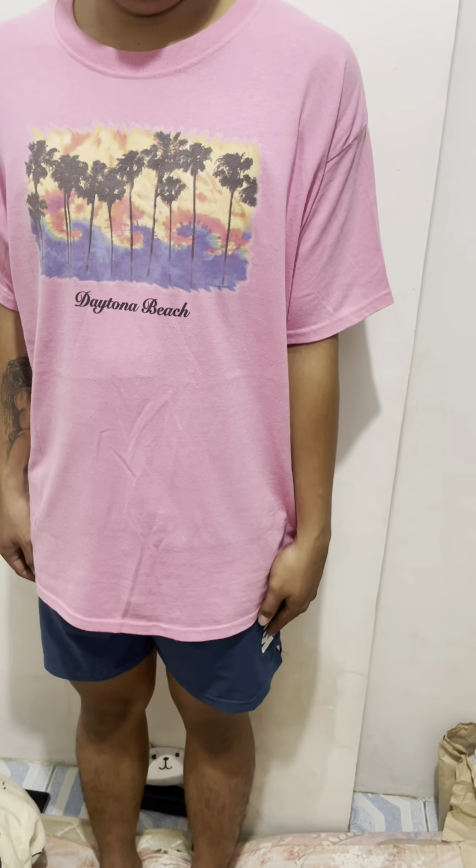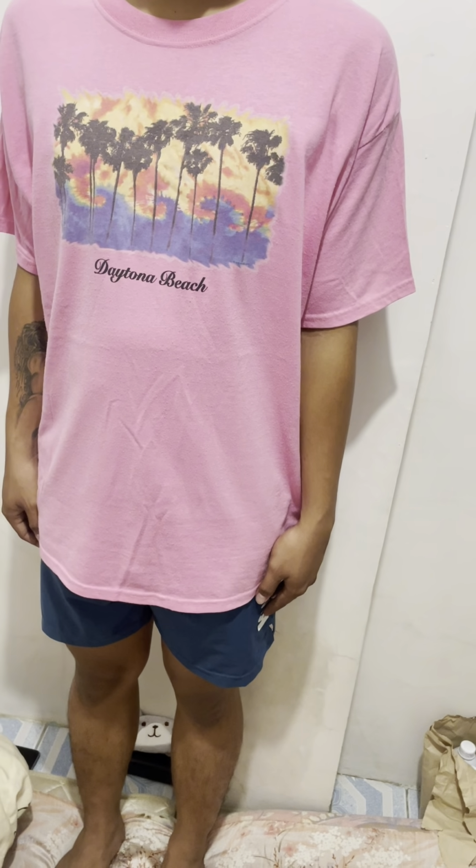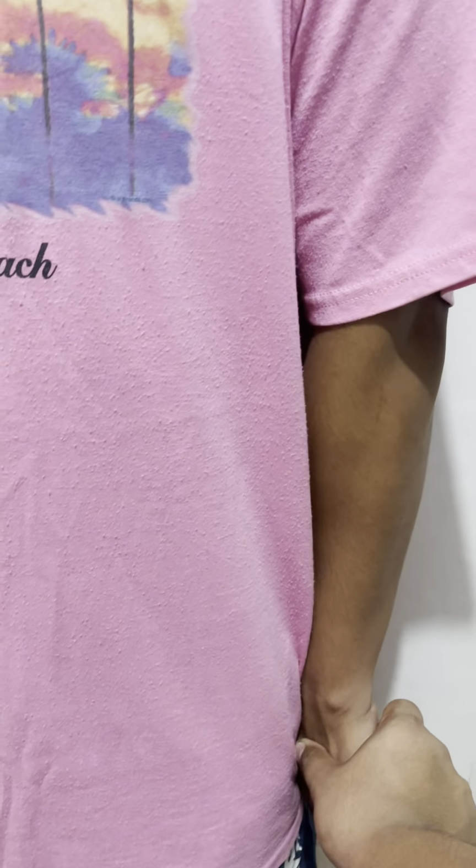Next naman po is internal rotation. Makikita po natin dito ang humerus in true lateral position. Ganito po. Internal rotation. Ganyan po siya.